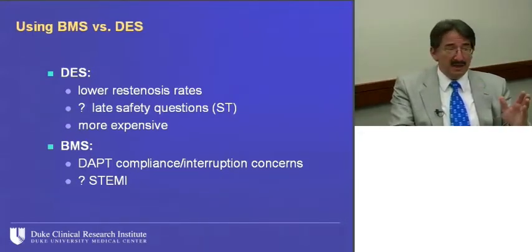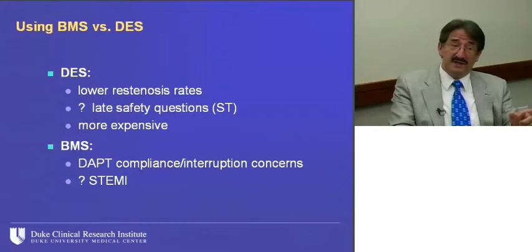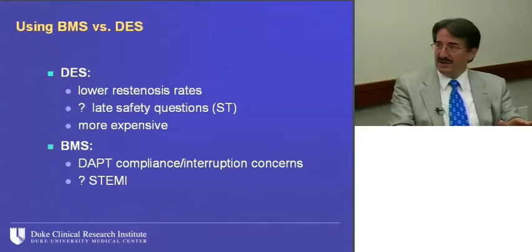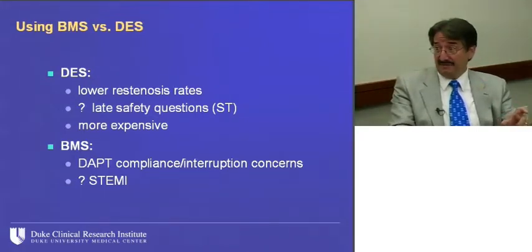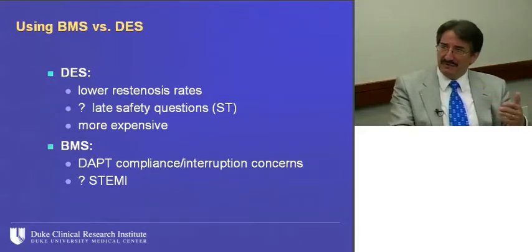And why? So drug-eluting stents, clearly effectiveness across the board, all 4 approved platforms in the U.S. have lower restenosis rates in randomized head-to-head trials than any bare-metal platforms, even modern cobalt chromium platforms. The late safety questions about stent thrombosis, I think, are what have haunted this issue, and how long and what sort of dual antiplatelet therapy goes along with the safety of these devices, as well as the technique for their implantation. What about overlaps? All of these other lingering long-term safety questions.